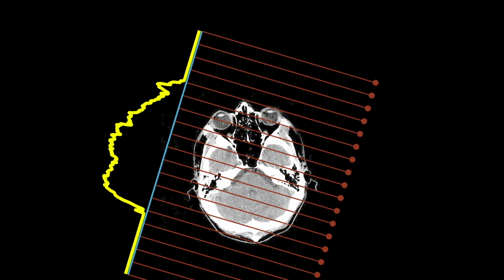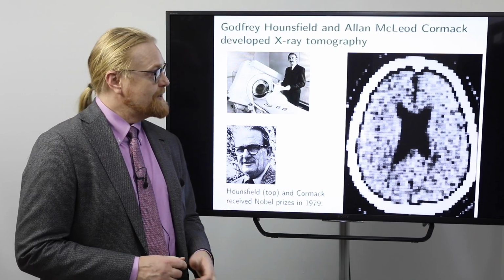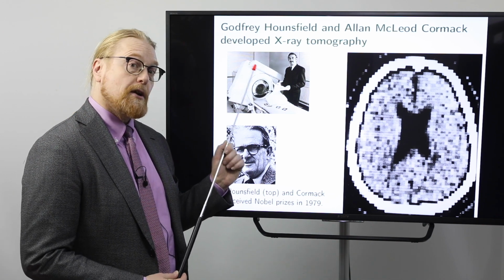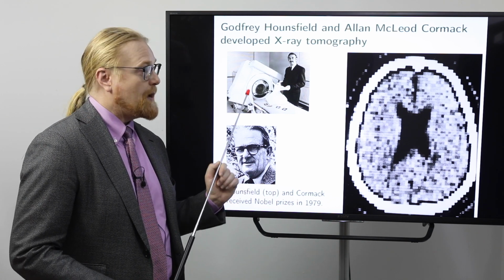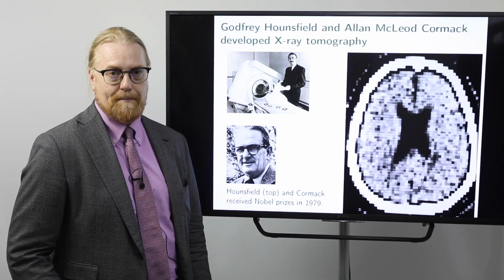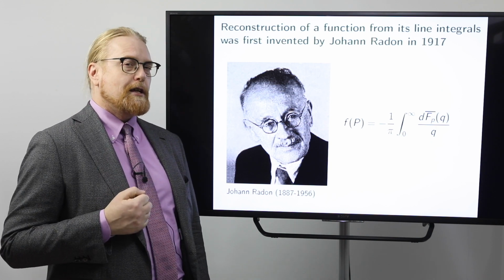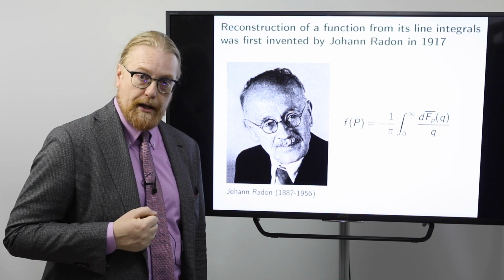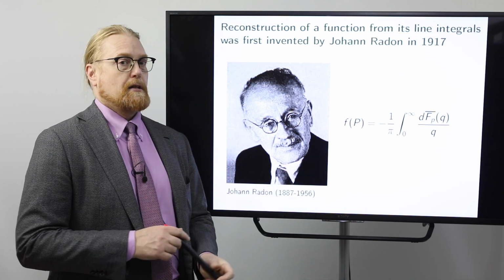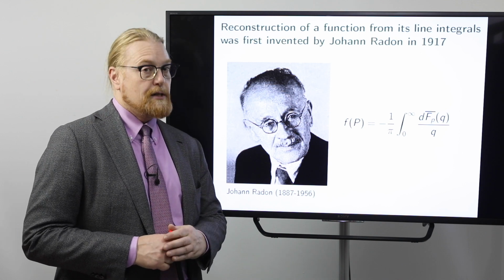This technology was first invented and implemented by Cormack and Hounsfield. This is Hounsfield's original device. You can see the linear movement part here and the rotation around the patient's head. And this is one of the original slice images recorded by Hounsfield. Also, let me note that the idea of reconstructing the image from these line integrals from all directions was already an old idea dating to 1917. This was Johann Radon's celebrated theorem, although Cormack and Hounsfield didn't know about it.